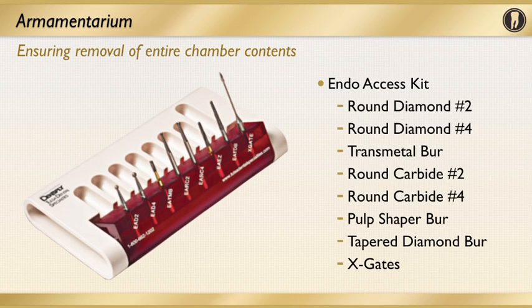Here's an actual great endo access block. This has the number 2 surgical round burr. It has your transmetal burr to cut through metal. It's got the surgical length round burrs that I discussed, and it also has the long diamond for the refinement and the straight line access. Also, there's the X-Gate for the open orifice or the coronal flare if you need that. So there's a lot of great burrs in this endo access kit.